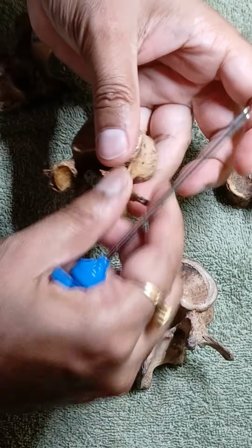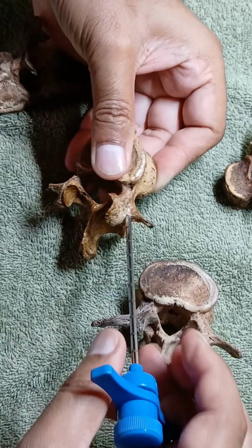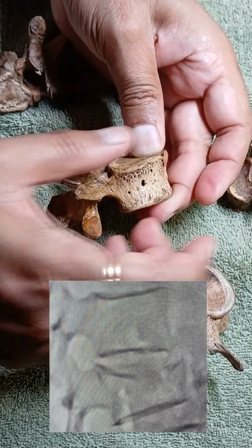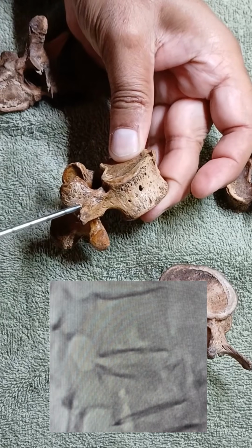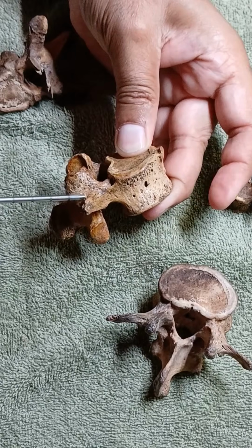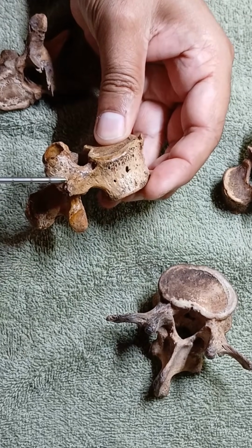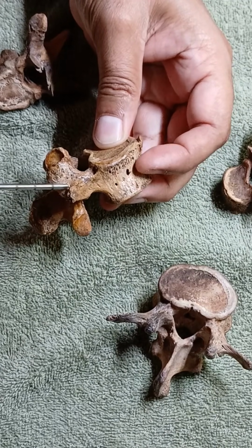Once I take the first entry, then you will go to the lateral view. Now you can see how the trajectory will be calculated, because this part is collapsed. After taking this first bite, you have to change the trajectory in such a way that your needle goes in between the fractured vertebra or the collapsed end plate, in the middle part of the end plates.